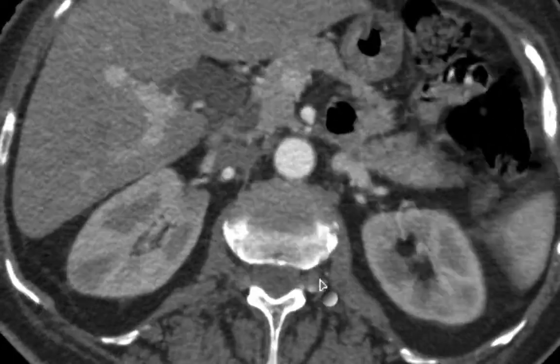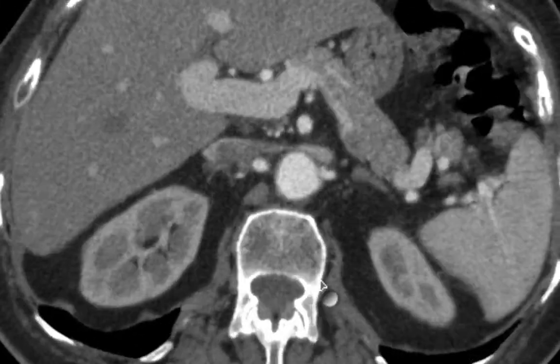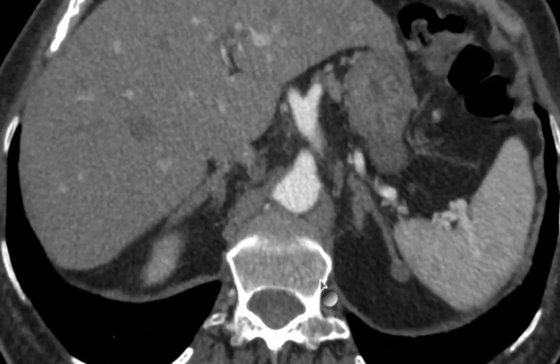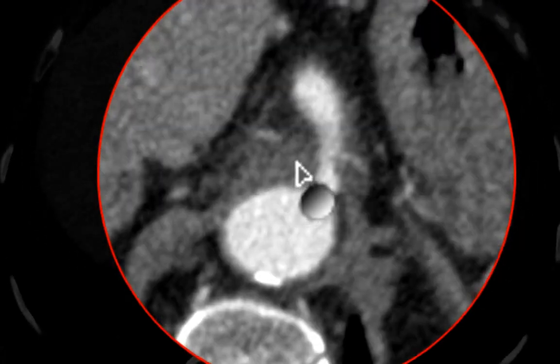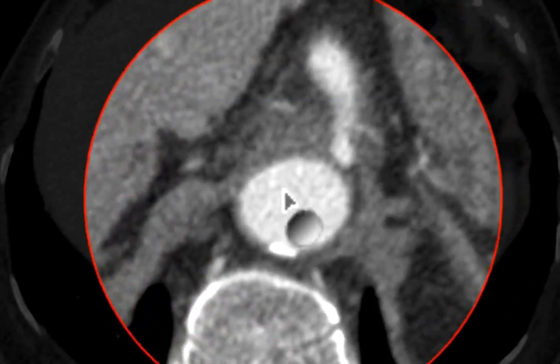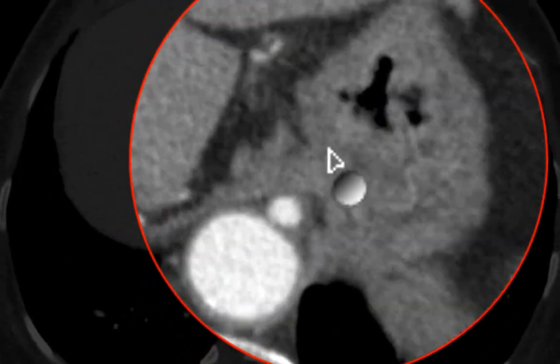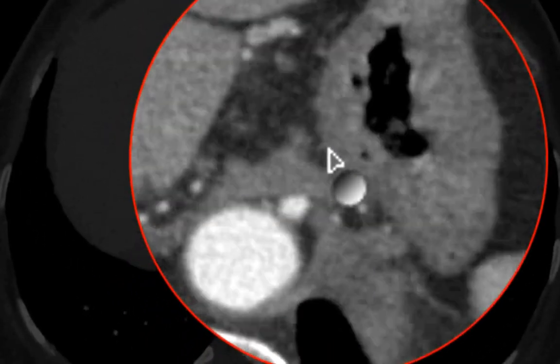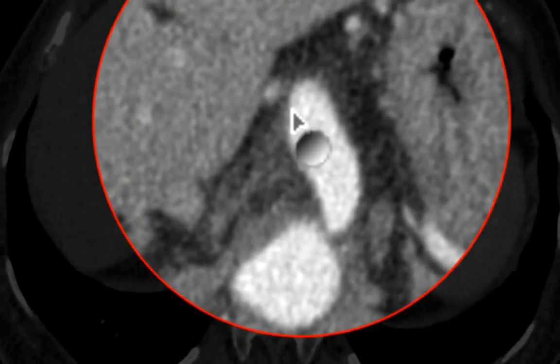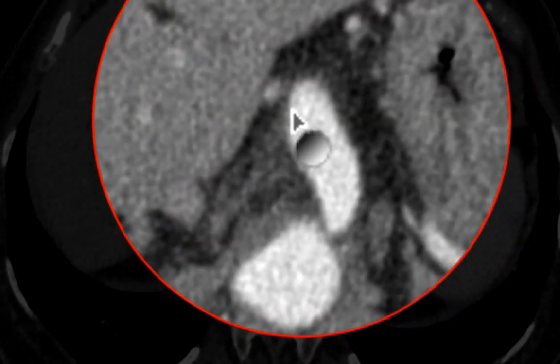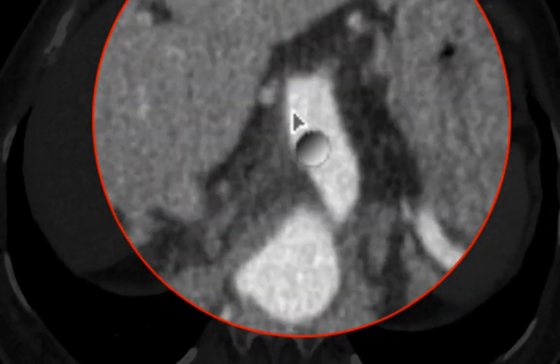Looking carefully at these images, you might have noticed that the proximal celiac artery is stenotic. Additionally, the stenosis is followed by post-stenotic dilatation. Now such findings might be very difficult to see on an axial acquisition.